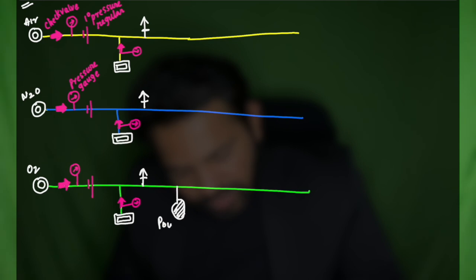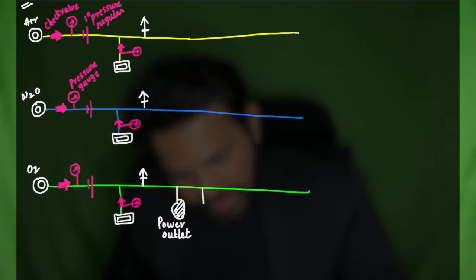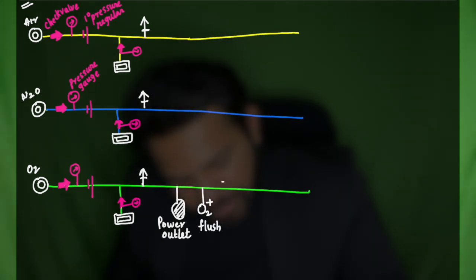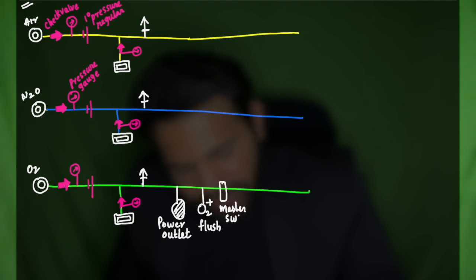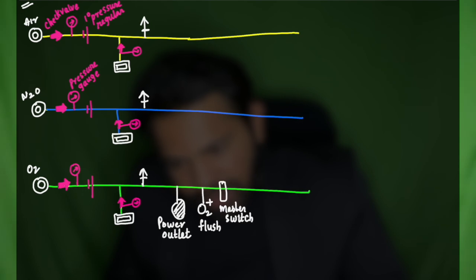Then there is an attachment for oxygen flush. Then there is a master switch. Alright. Then there is an oxygen pressure alarm.